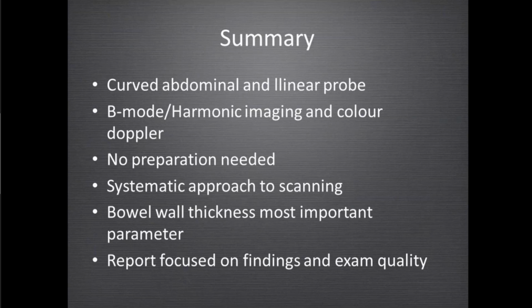Bowel wall thickness has been shown again and again to be the most important parameter. And you should report your findings. The report should be focused on the findings and also on the exam quality.